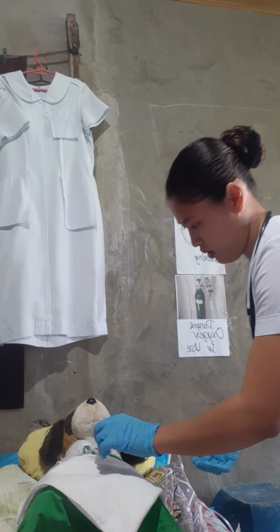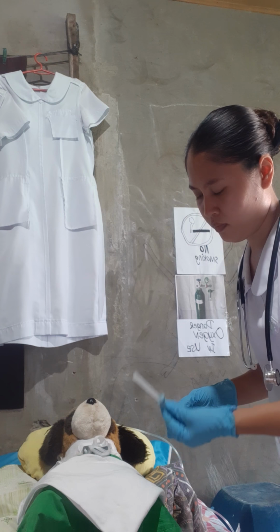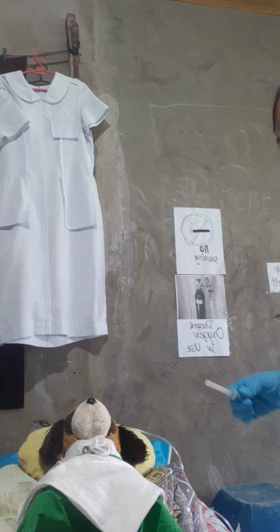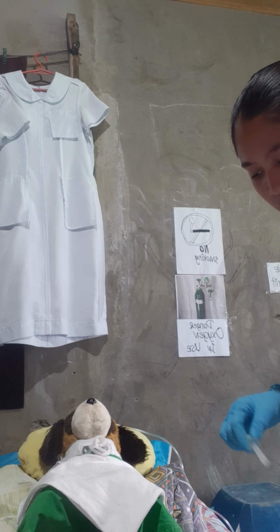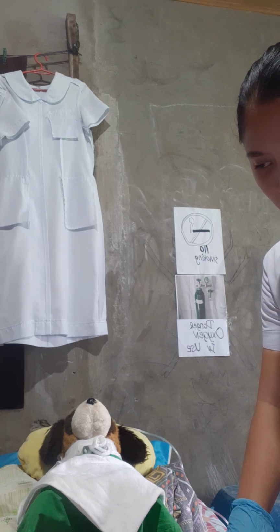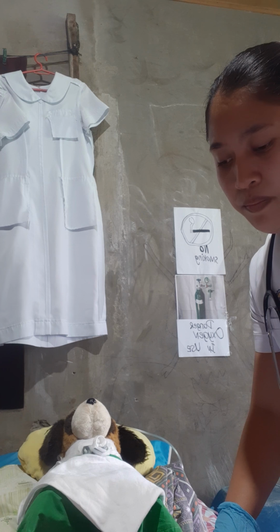Then we're going to open this one counterclockwise, then remove it, and we're going to clean this using the saline, or we're going to put this one in a basin with saline and hydrogen peroxide.